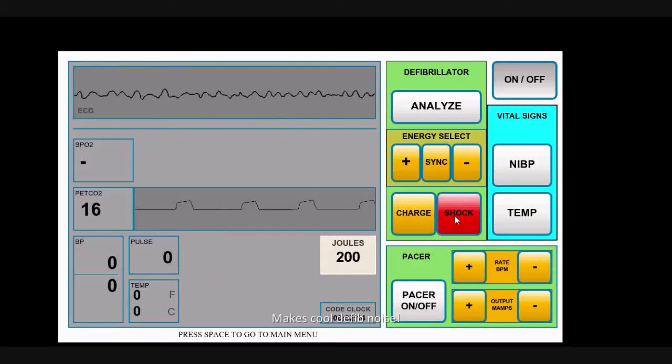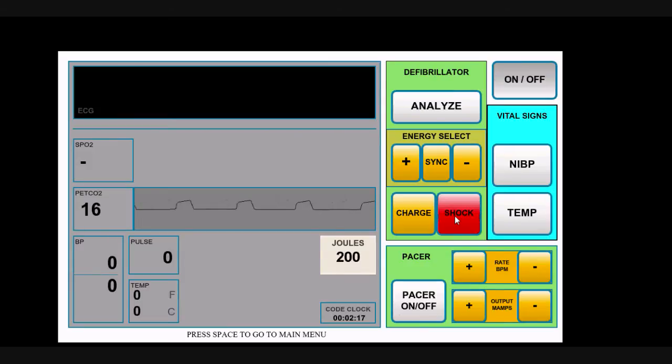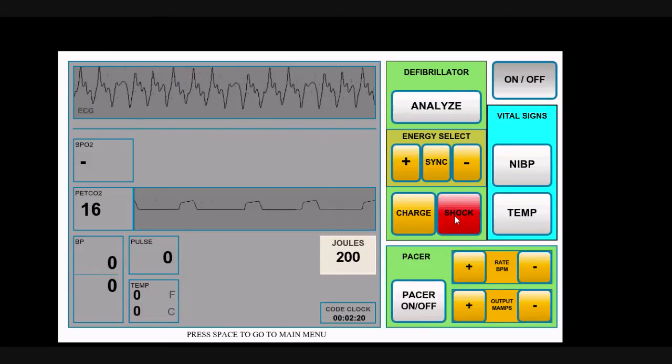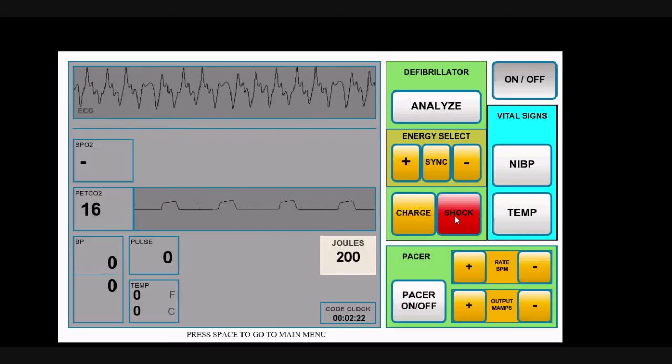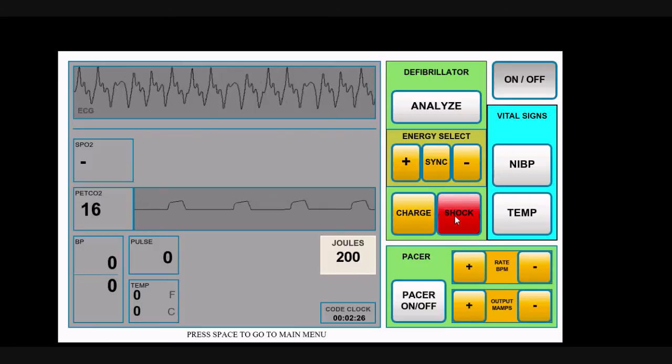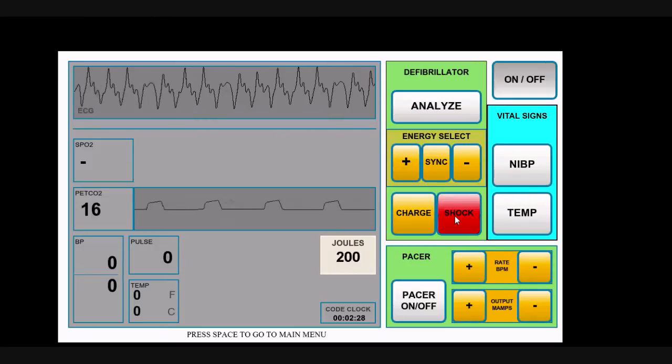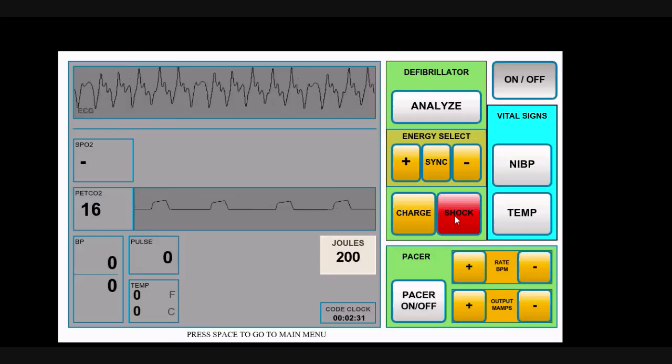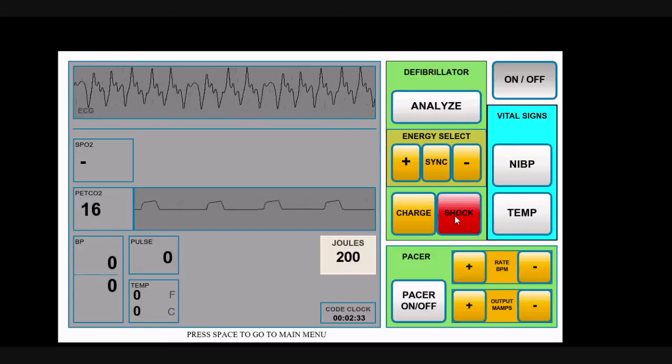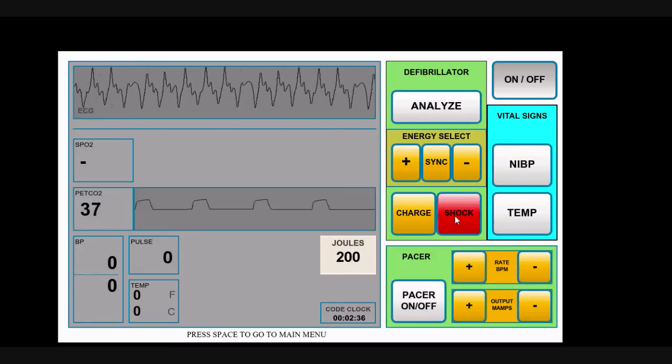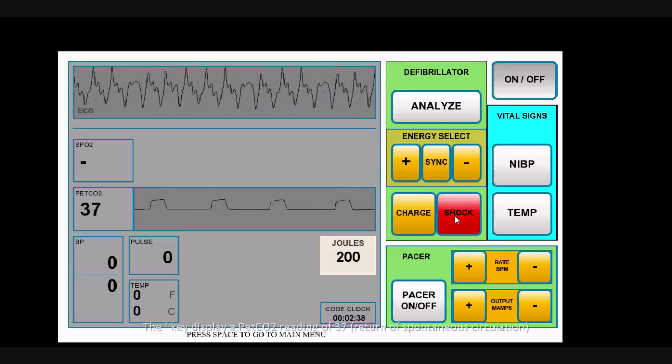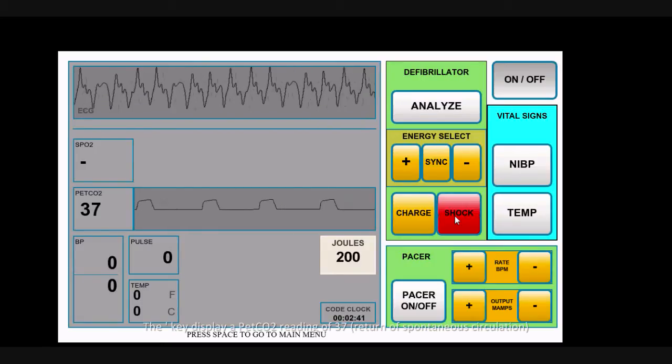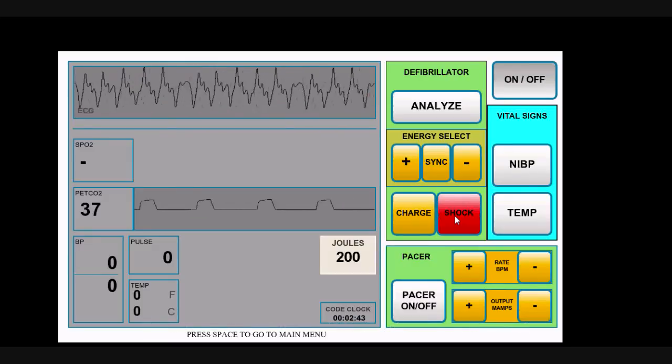They would go ahead and introduce their pressor and other types of therapies. We're now in our second period of CPR. Let's say they've given their antiarrhythmic, perhaps an amiodarone. The trick here is to see if the student really understands the use of capnography. If you want to be subtle about it, you could give them an increase in CO2 but tell them nothing to see if they understand that this is consistent with the return of spontaneous circulation.